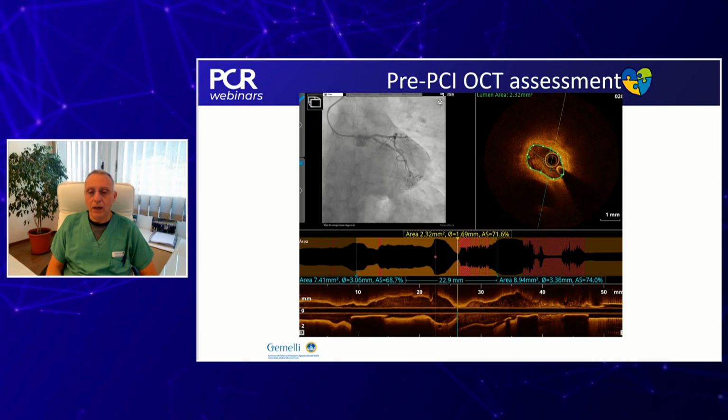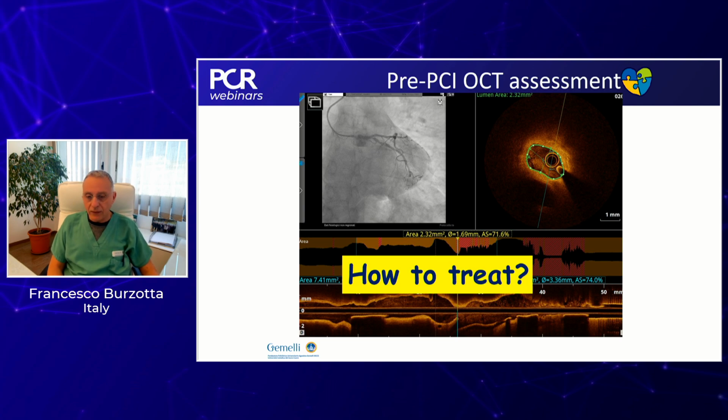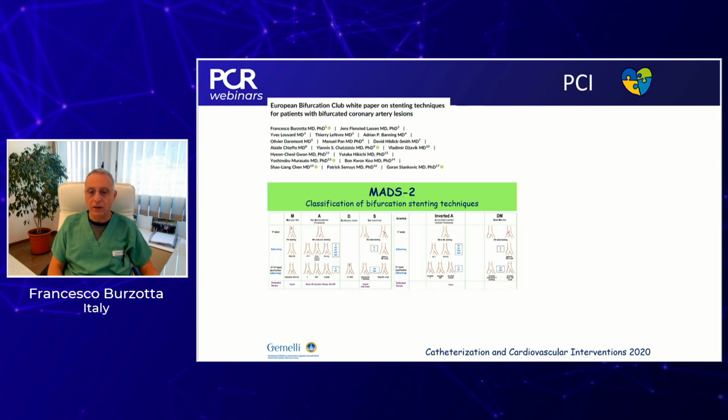So, first of all, I want to say that on the basis of the imaging, all your pre-planning based on angiography only was confirmed, because you definitely see in the long axis view how the plaque looks to be exactly opposite the carina. You can see it in the long axis view. Regarding the strategy we discussed, when you have a condition like that, you are facing a bifurcation where the distribution of the disease is now clear. And as you anticipated, if we go for bifurcation stenting, putting the stent into the area where there is more plaque makes sense.